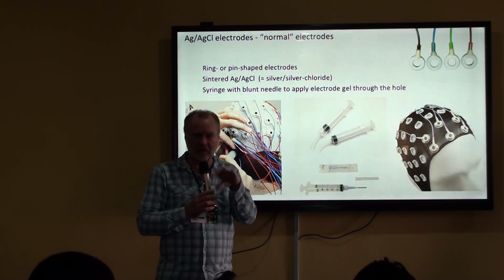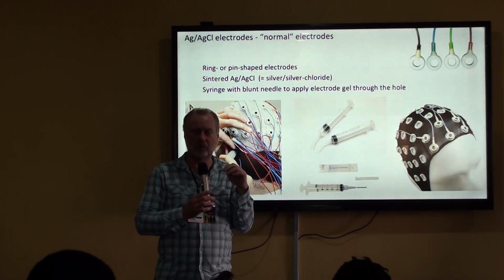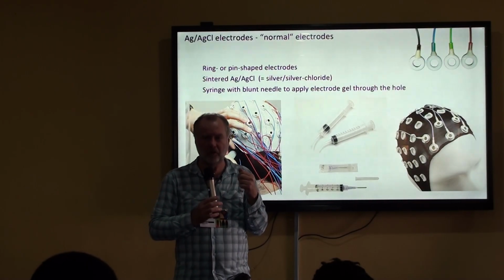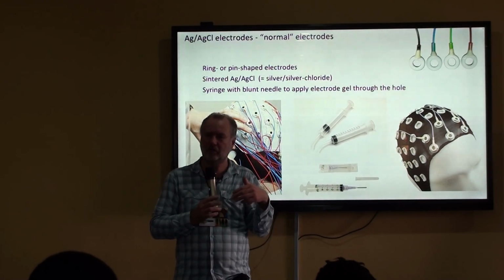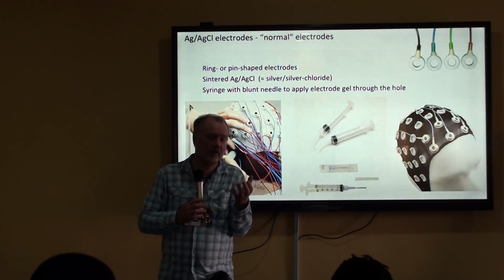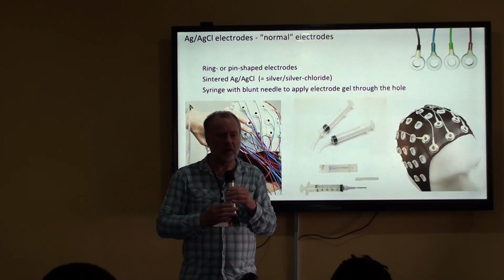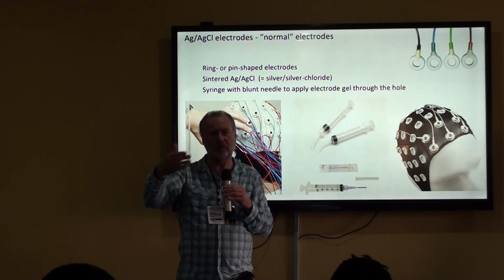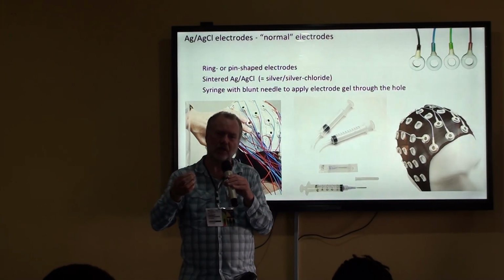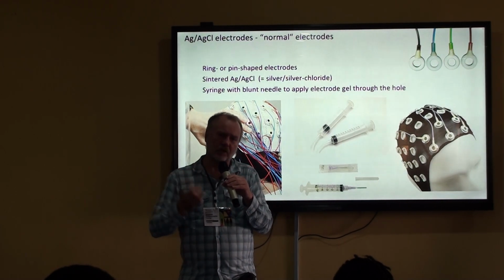And that makes it a little bit similar to having an EEG system at home, where just a regular person puts on the EEG cap. So in the laboratory environment where I work, so the labs that I showed yesterday on the video, we always have trained staff to apply the cap. But I think for remote monitoring of EEG, an important consideration would be how do you get the electrodes correctly in place, and also how do you make sure that the electrode system is robust?